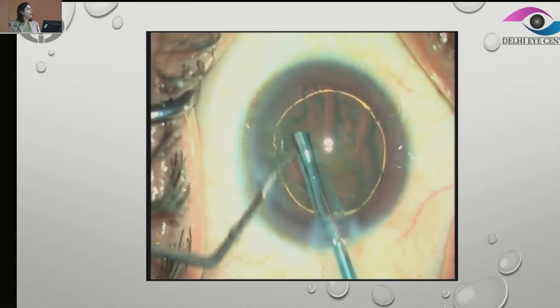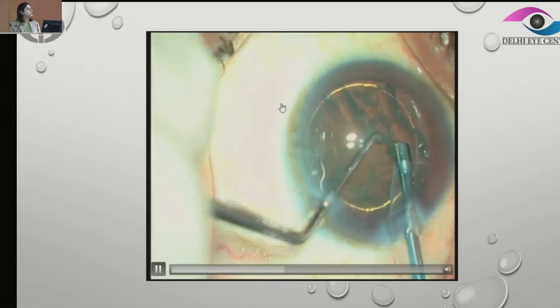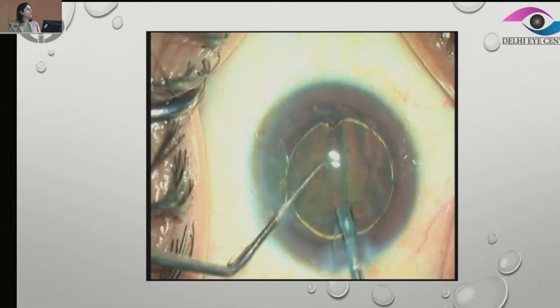Now see how far we are going into the periphery. As beginners, if you feel it's a little risky to go that peripheral, we can limit ourselves — but at least make sure the nucleus is a little freer so that it's easy for us to prolapse.